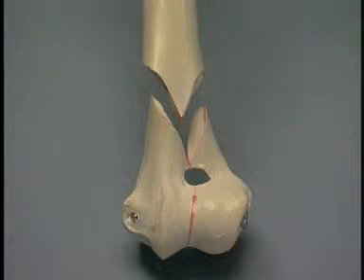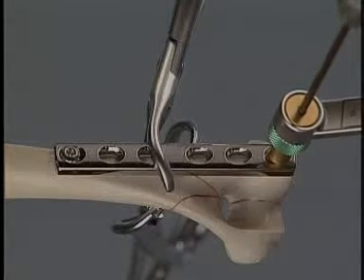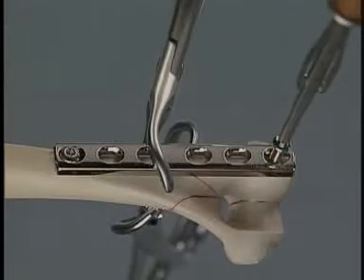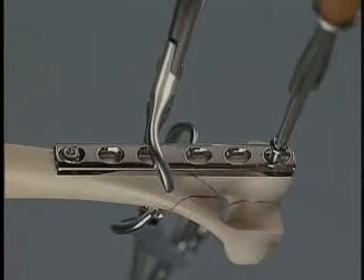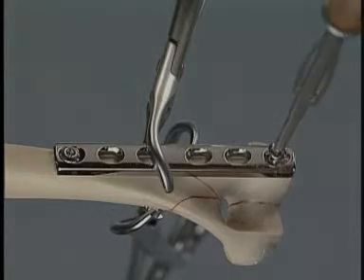The fracture has been reduced to two fragments, which will now be stabilized. The plate may be placed on the caudal edge of the medial aspect of the humeral condyle. A screw has been fixed in the proximal end of the plate in the first screw hole. The next screw is inserted through the most distal hole of the plate, running in a caudal to cranial direction. By placing the screw in this position, a long screw can be used, which will give maximum purchase in the distal fragment.